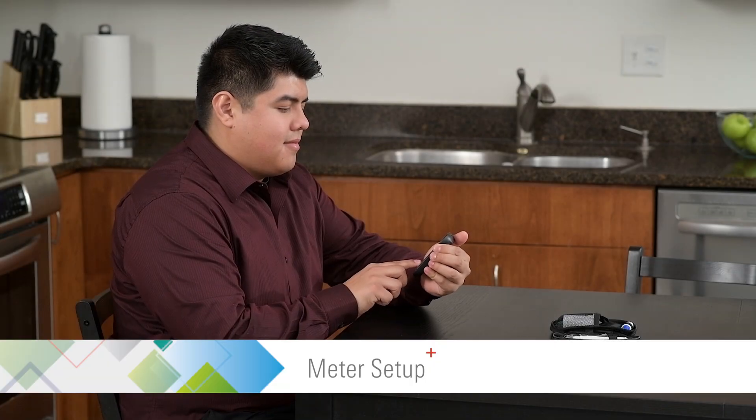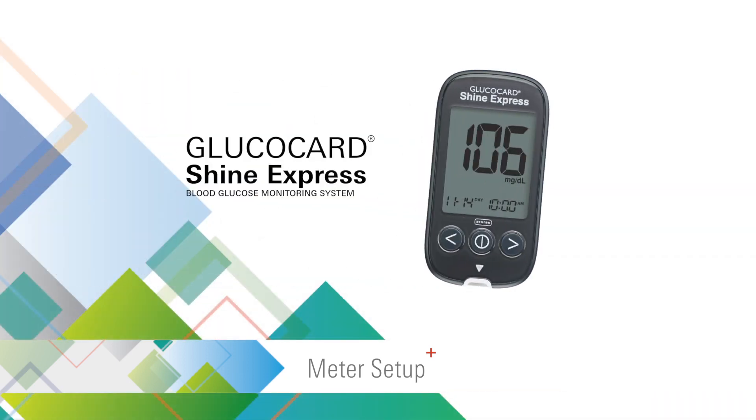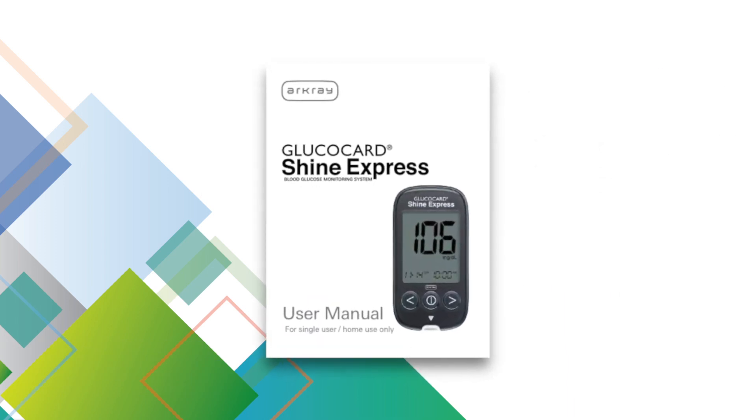This video provides an overview on how to set up the Glucocard Shine Express blood glucose monitoring system. For complete instructions, please see the user manual supplied with the meter.